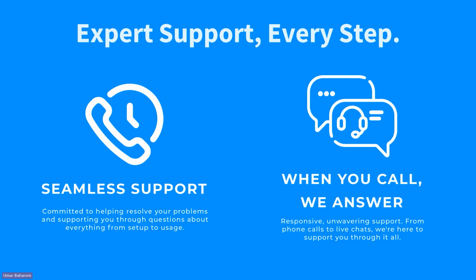Okay. And there was another question on the resolution of the MRgRT Phantom. Again, the resolution of the fiducials themselves is 16 millimeters. So that's the resolution of the dots itself. In terms of the software analysis, it's about 0.2 millimeters. That's the resolution that you can detect. Hope that answers your question.